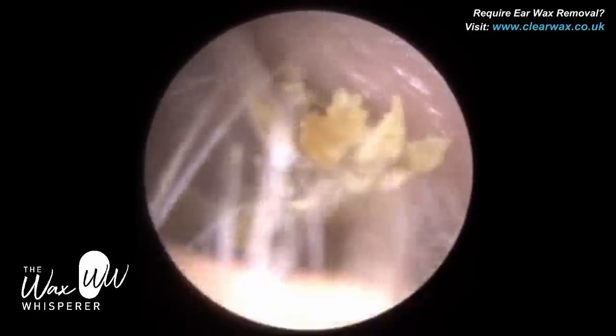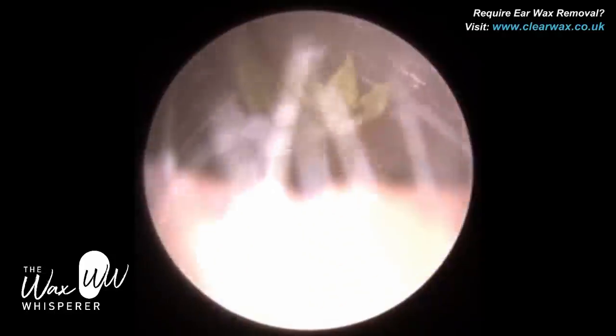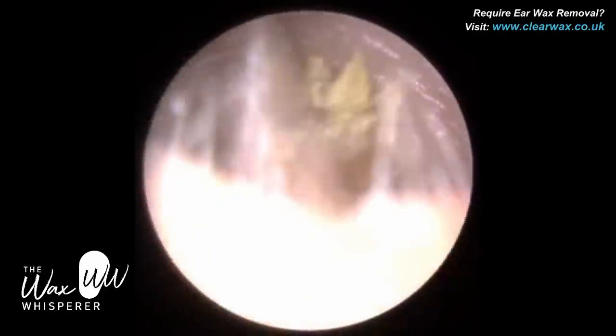In both ears, at the end of the procedure, you'll see there's wax on both of the eardrums. That's where you need depth perception to remove the wax.